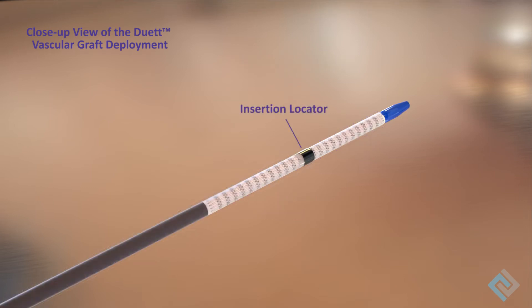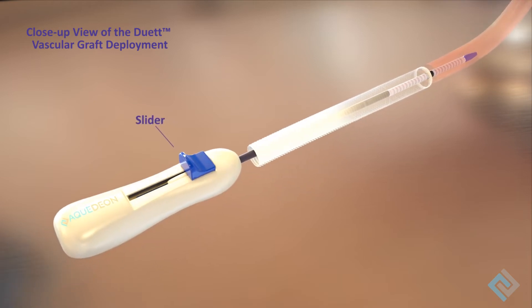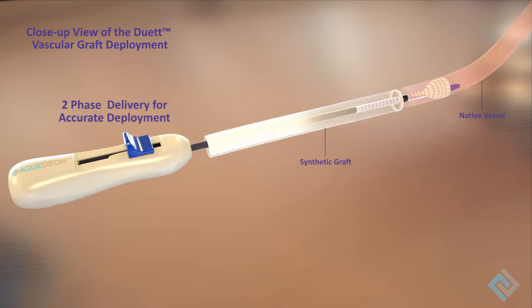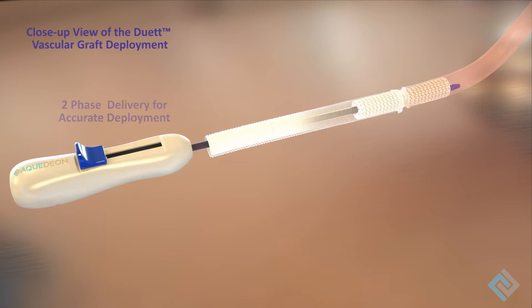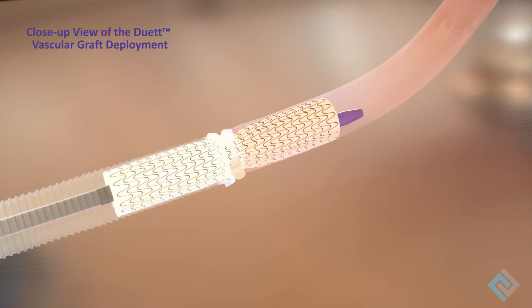The insertion locator indicates the center of the Duet Vascular Graft. The delivery system has a dual-action slider. The first activation of the slider deploys the distal half of the Duet Vascular Graft within the patient's native vessel. The slider then returns to the original position. The second activation of the slider completes deployment of the Duet Vascular Graft and the anastomoses to the synthetic graft.